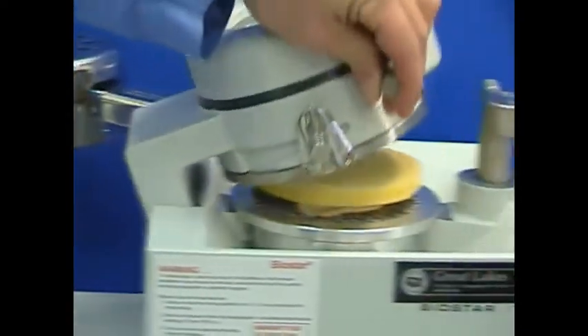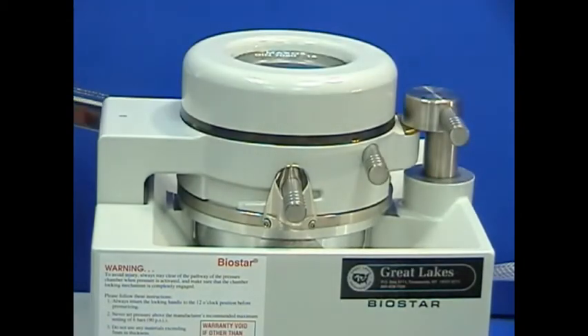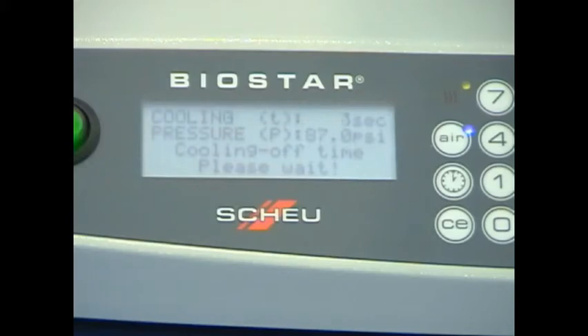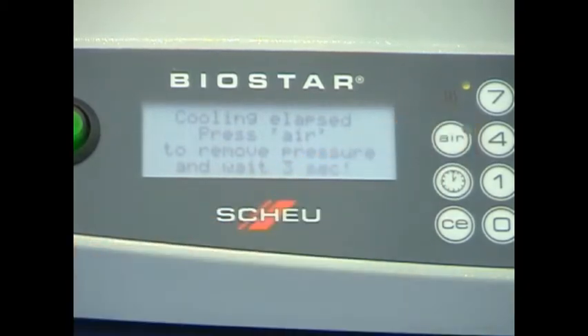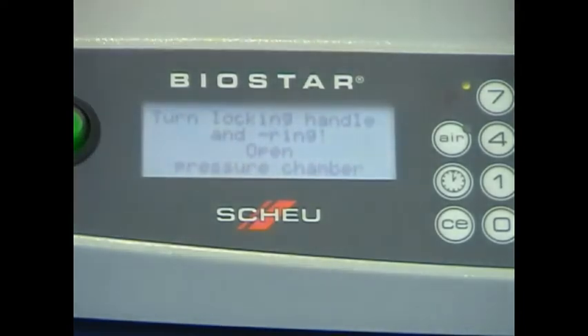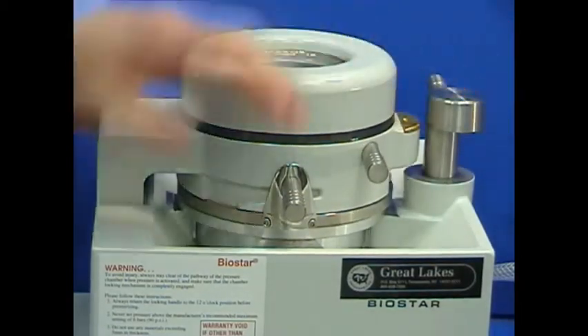Swing the chamber over the model and spacer foam in the pellet cup and lock the chamber in the cooling place. Allow to cool under pressure for 2 minutes. At the end of the cooling cycle, release the pressure from the chamber, then unlock the chamber and clamped material.